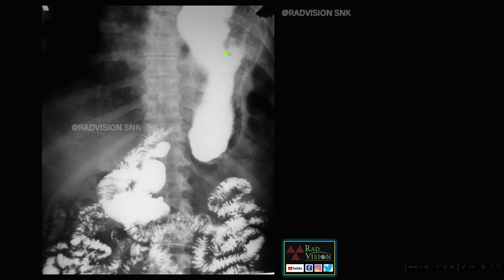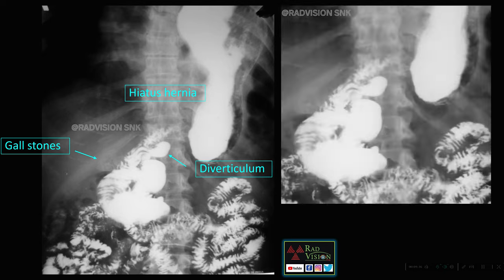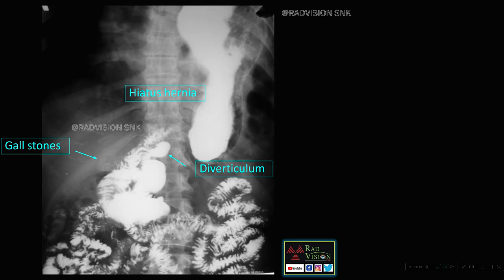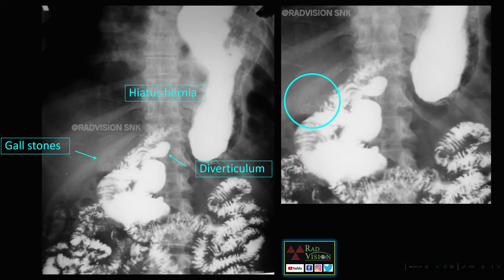Here you can see a diverticulum, a hiatus hernia, and faint gallstones. These are the gallstones, this is the hiatus hernia, and this is the diverticulum. Whenever you see gallstones with hiatus hernia and diverticula, suspect Saint's triad.